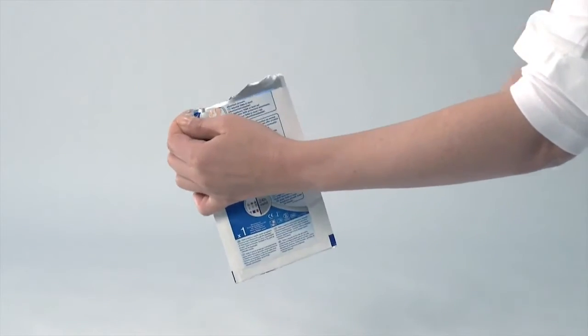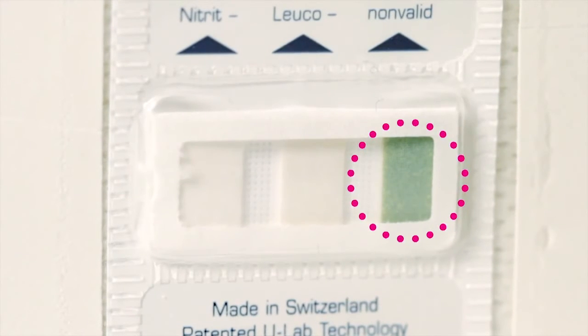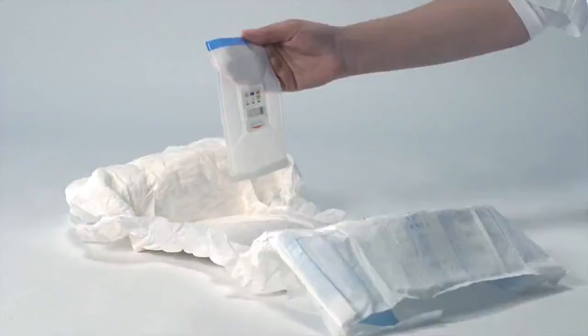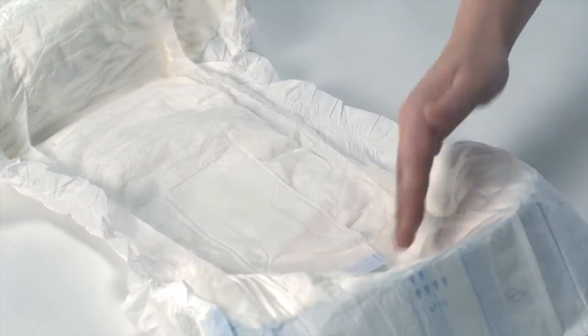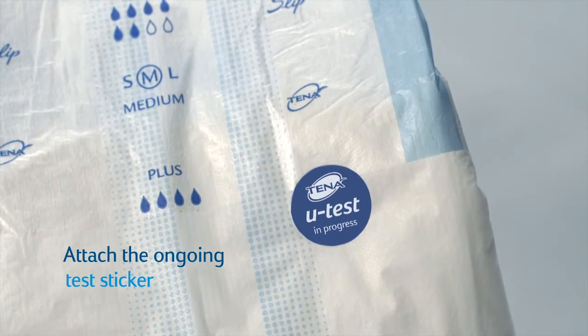Remove TNAU test from the aluminium packaging and use the test straight away. The green validity indicator shows the test is ready to use. Remove the peel-off film from the adhesive fleece by using the blue strip. Put the adhesive side of the test into the clean pad. The integrated test card should approximately be at the same level as the opening of the urethra.